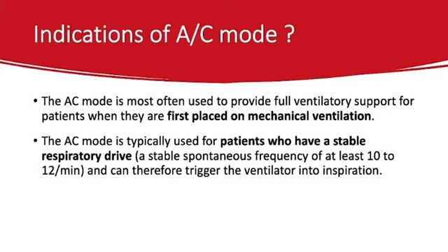Indication of the AC mode. Simply, the AC mode is most often used to provide full ventilatory support for patients who are first placed on a mechanical ventilator. I know some RTs put the patients on the AC mode as the initial setting, volume control AC mode.